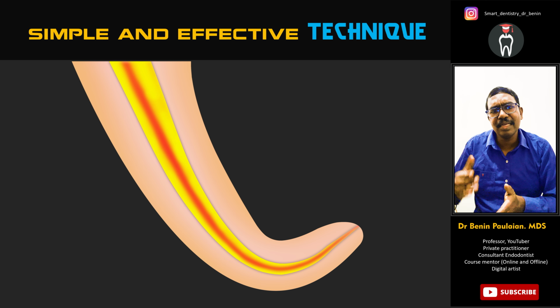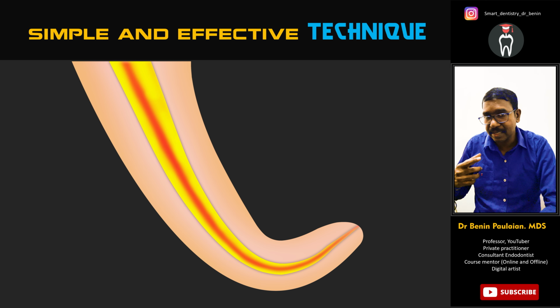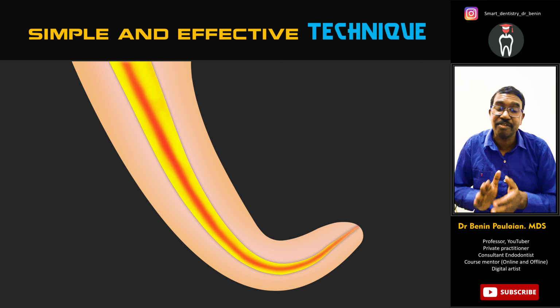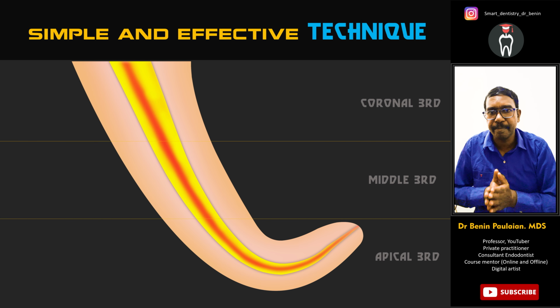So let's take up a root canal where you can see that there is quite a lot of calcification. First thing that you have to do is divide the root canal into three parts, as we always do for cleaning and shaping: the coronal third, the middle third, and the apical third.